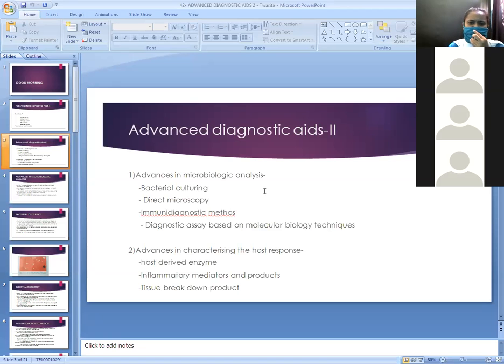Another radiographic technique is CADIA, that is, computer-assisted densitometric analysis. Densitometric analysis means you are going to check the density of that particular bone. The radiograph is kept on a screen and light is passed through it, and it shows you the defect and whether regeneration is taking place. For that purpose also you need to arrange sequential radiographs superimposed over each other, and then you will find whether bone formation has taken place or not.